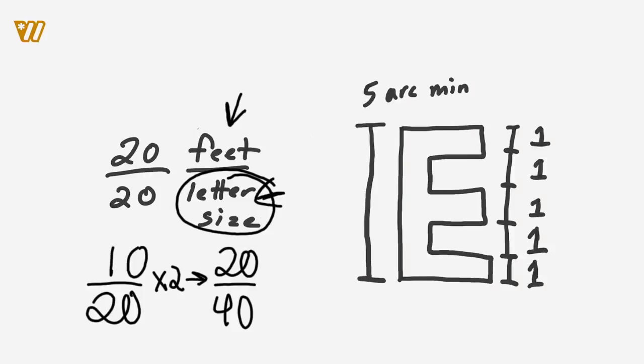Let's look at the E, and this one makes it really simple because there are 5 distinct bars, where you would have light and dark bars on your E on your 20/20 line, your TZVECL. If you don't have all those memorized with your basic package of letters, you'll get there. So whenever we look at the E, what does a 20/20 E, or a letter size 20, mean? It means that the total size of this letter is going to be 5 arc minutes, with the detail, each bar of that E, being 1 arc minute.